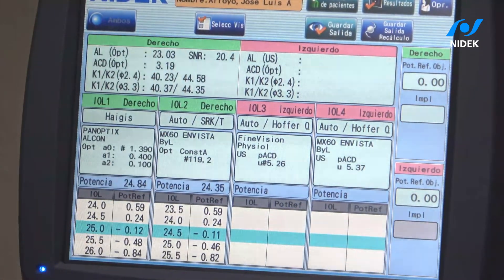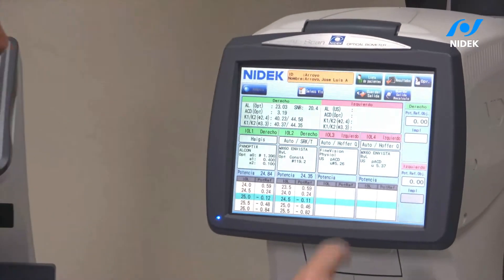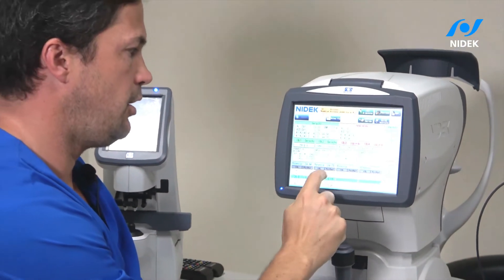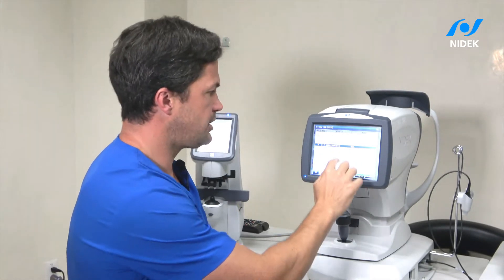I already have a fourth-generation formula with a trifocal IOL. I can also use Camellin-Calossi or Shammas, which are two formulas that come with the device and are very good and very accurate, especially for post-LASIK patients.